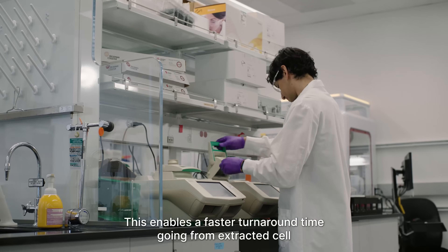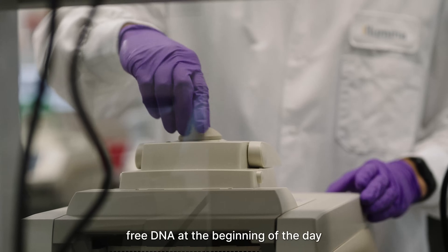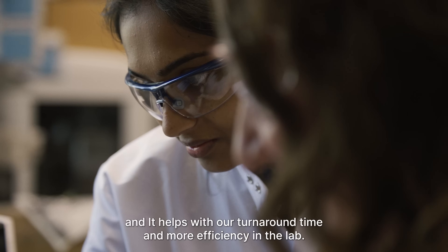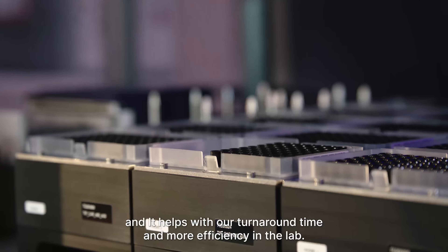This enables a faster turnaround time, going from extracted cell-free DNA at the beginning of the day to a library that's ready to pool and sequence by the end of the workday. The workflow is simpler, shorter, and it helps with our turnaround time and more efficiency in the lab.